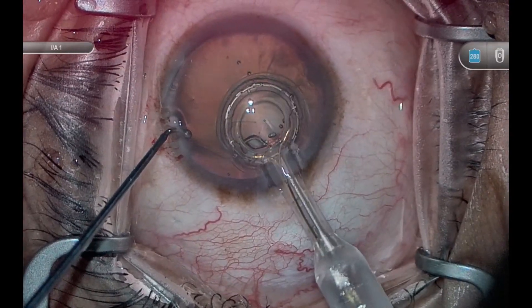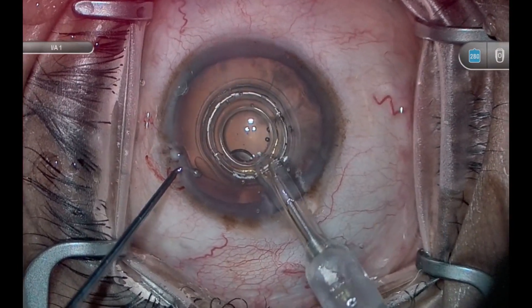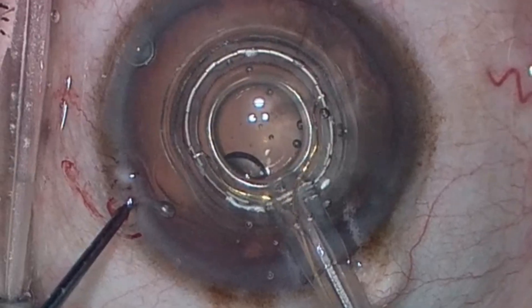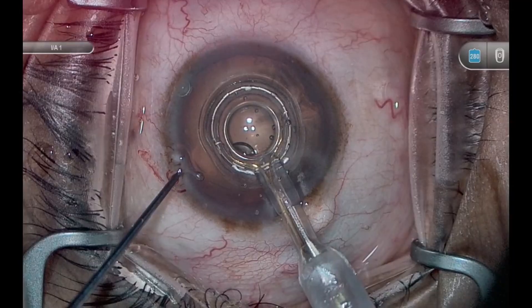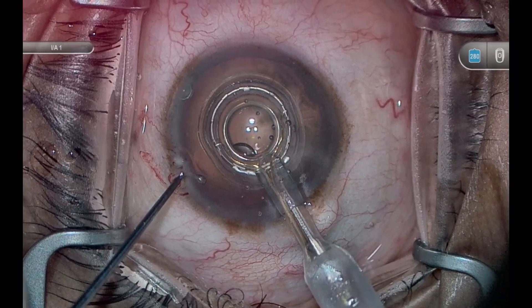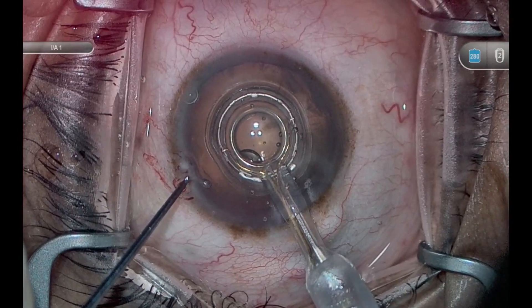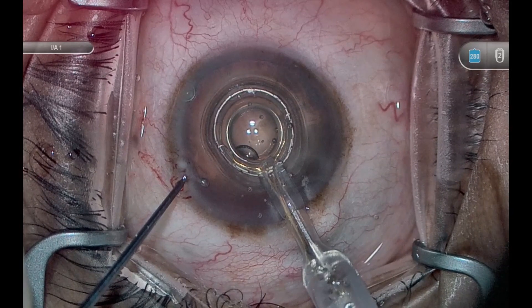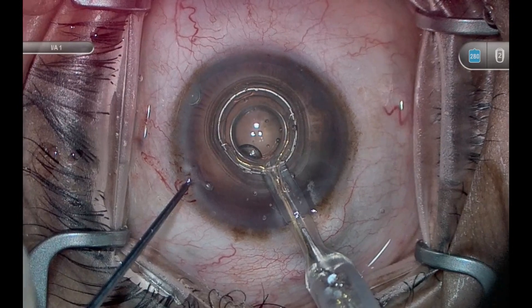Once you're in the anterior chamber, retract the pushrod. Good centration is all based on pushrod management, so when you retract that pushrod, make sure the tip of it is about midway through the corneal wound. That's the sweet spot for me because it's a pivot point. It allows me to move the end of the Zeptoe 360 degrees — forward, backward, side to side — and make sure there's good centration. Use your second instrument to make sure you center the eye and get that Purkinje reflex right over the center of the cornea.